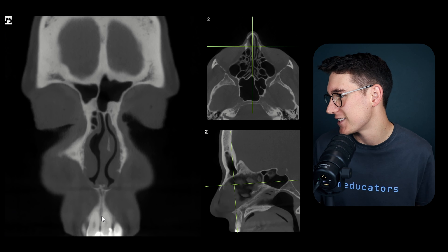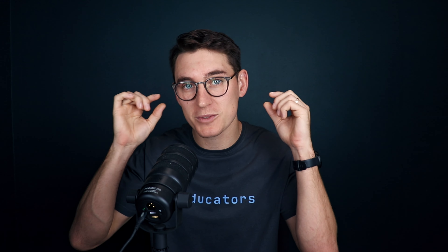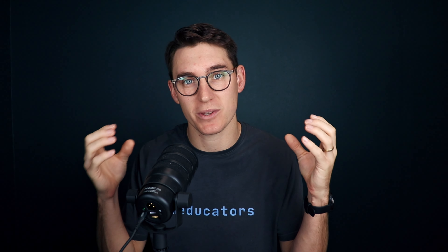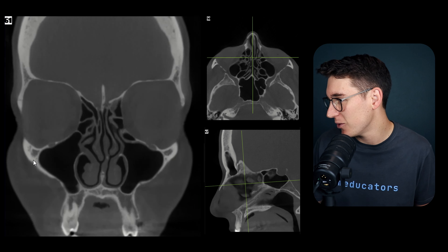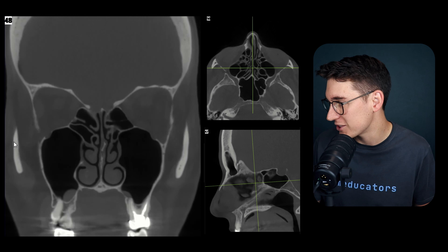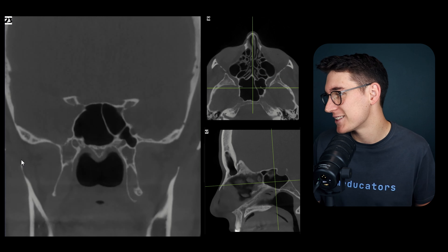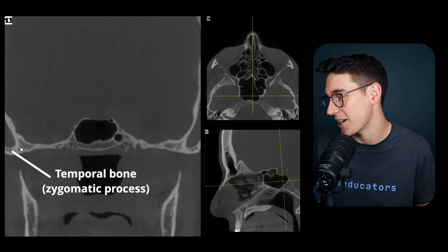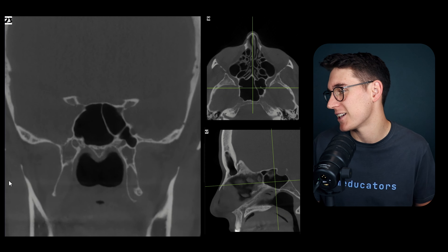Now let's find the zygomatic process on the coronal plane. The zygoma forms a zygomatic arch: anteriorly it's the zygomatic process of the maxilla joining with the zygoma, and posteriorly it's the zygomatic process of the temporal bone. Here we can see the zygomatic process joining with the zygoma, which forms the zygomatic arch. As we head more posteriorly we see the zygomatic process of the temporal bone coming off the squamous section of the temporal bone.